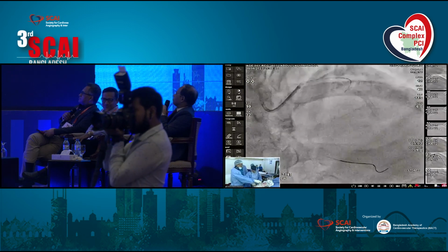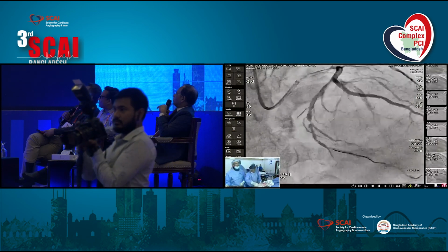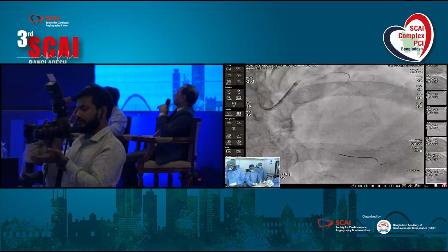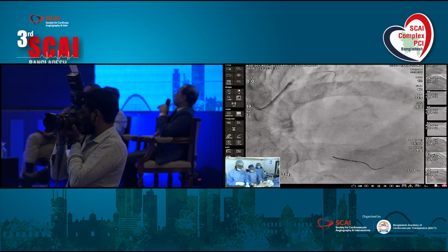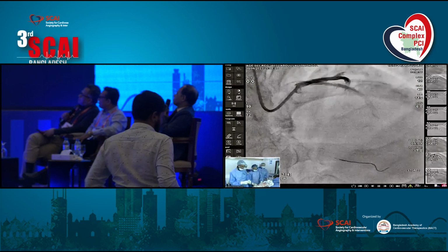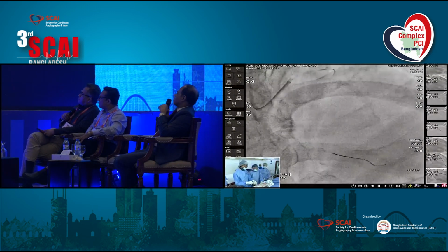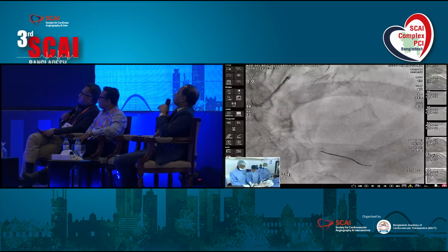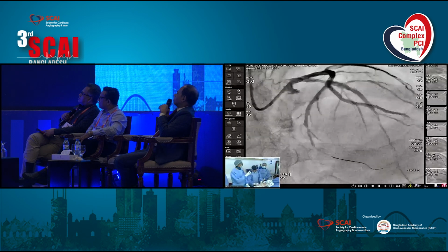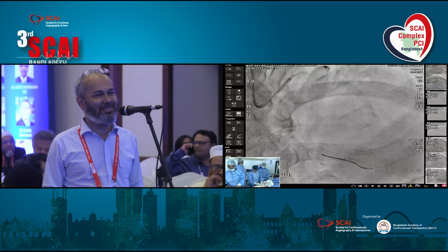Okay, thank you, Professor Azam. We shall be able to complete by this time, and simultaneously, sir, you can introduce your cath lab team as well, because from the very beginning, I think you may forget to introduce everyone. So far, I know you. You know me and Safi. We know, but we love to listen from your side.